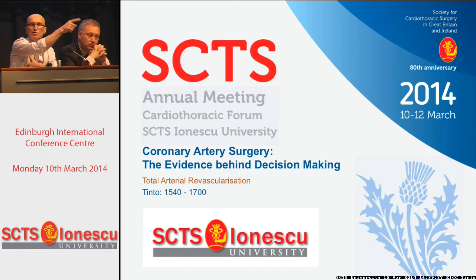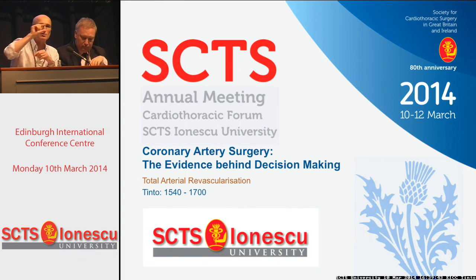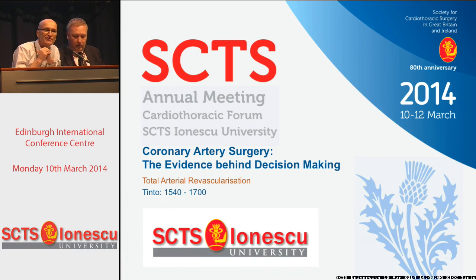Try and go to the Medistim. I think they've got a stand here, but go and see this because it's actually quite dramatic. You can see the whole anastomosis, you can see flow into it, out of it, you can see the flow in both directions. And when you see that, you know. So even if you have low flow in your graft, even if the pulsatility index is higher than you would have liked, you're still reassured you cannot do better than that. So the beauty is you do not have to redo the graft.